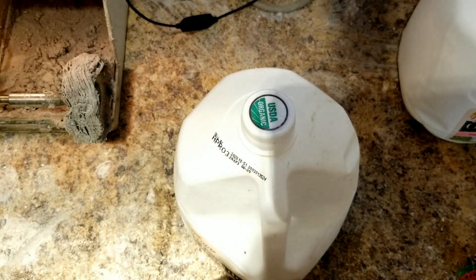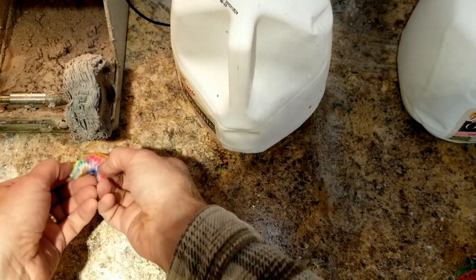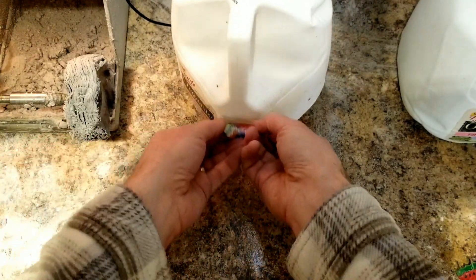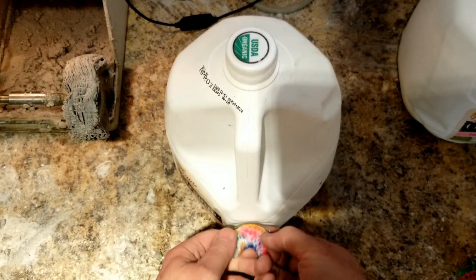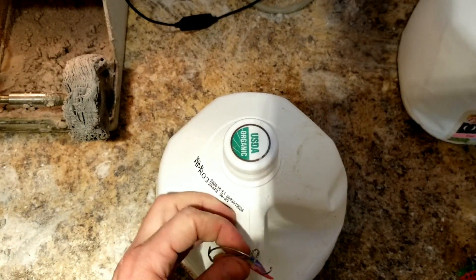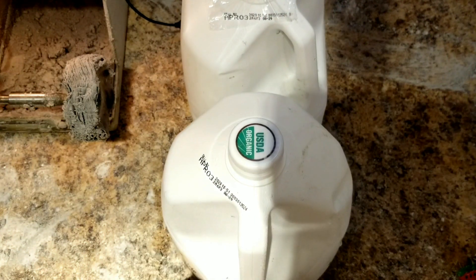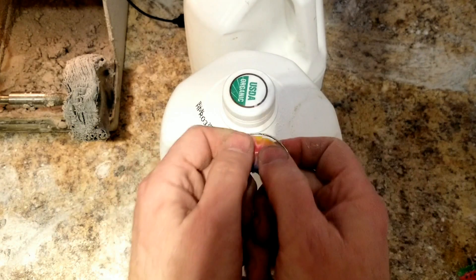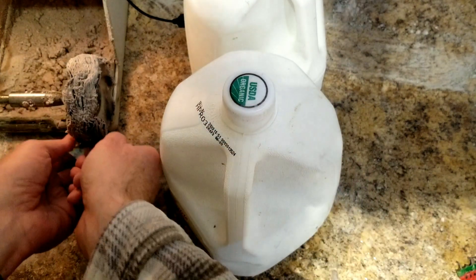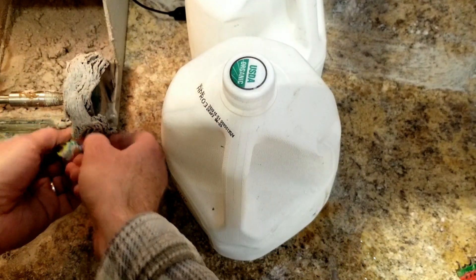For instance, if it's one gallon, this is nothing — way too light of pressure. So when I'm pumicing and polishing, if you can move this easily, that's too light. But if you take two gallons — 16 pounds — and you're moving it, I'm putting pressure on it. That's the exact pressure that I'm using pushing on this wheel as it's spinning.